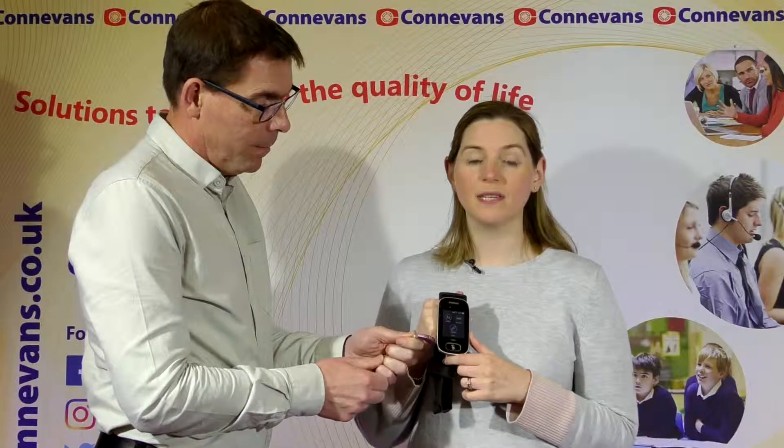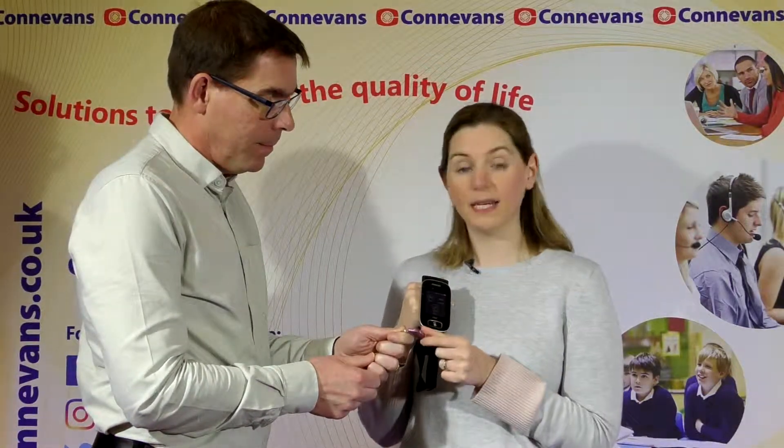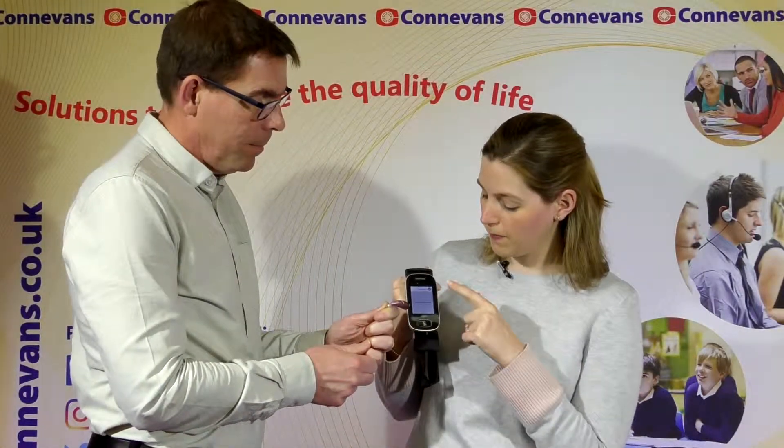This is how you connect up a network using a Roger touch screen mic. You have to have the Roger receivers really close. Here we've got a hearing aid with an integrated receiver and the touch screen mic — you just push the connect button, tick, a Roger 15 is connected.